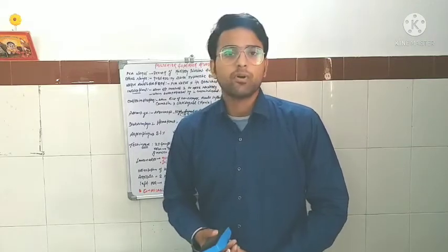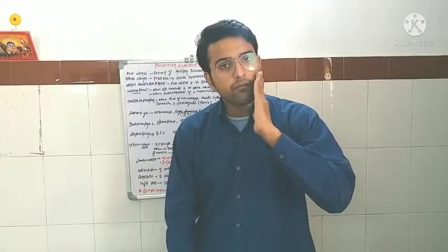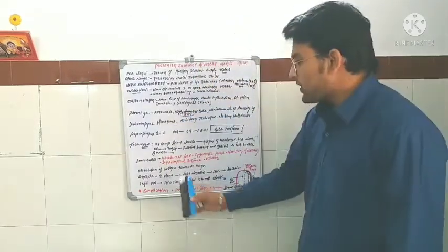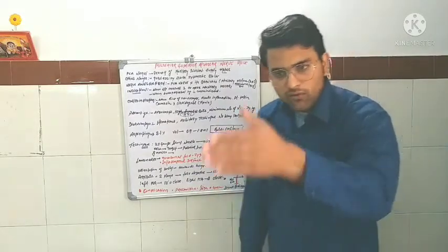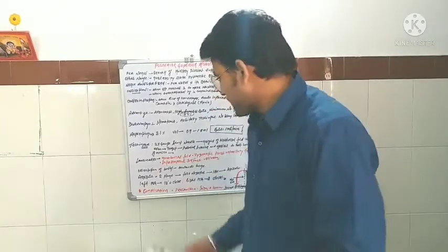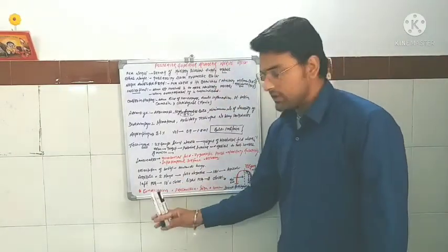So the landmarks are first the mucobuccal fold, the zygomatic process of the maxilla, the infratemporal surface of the maxilla, and the anterior border of the ramus of the mandible, and the most important thing is the mucobuccal fold above the maxillary second molar. The orientation of the bevel after inserting should be toward the bone. Aspirate in two planes, because of one-time false negative, which I have already discussed.